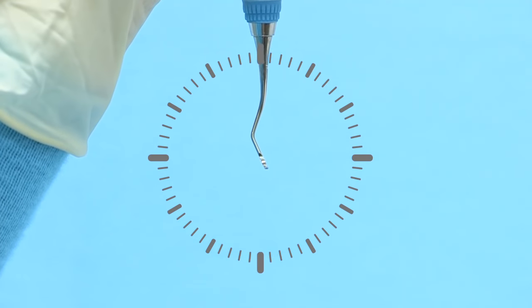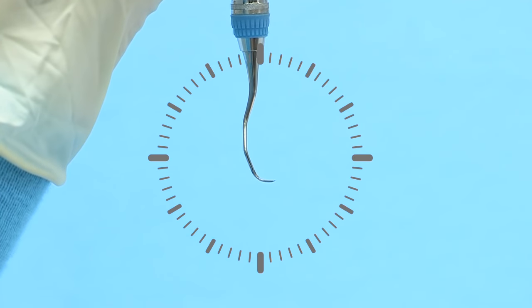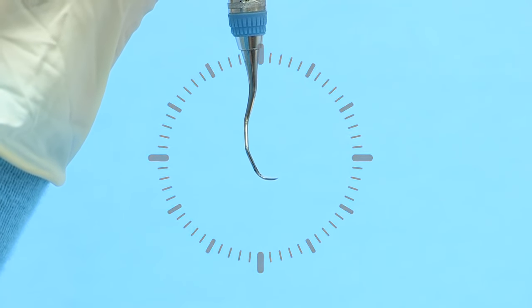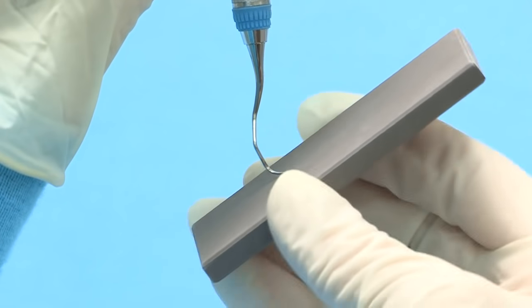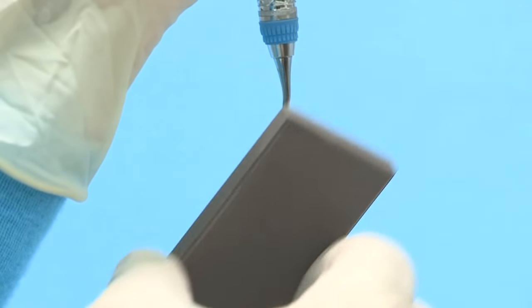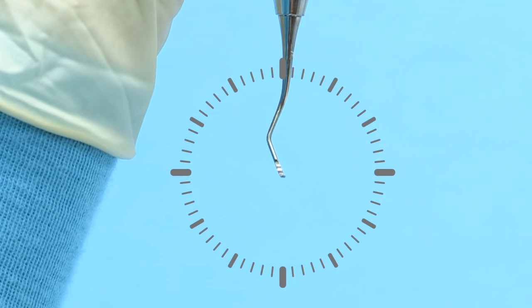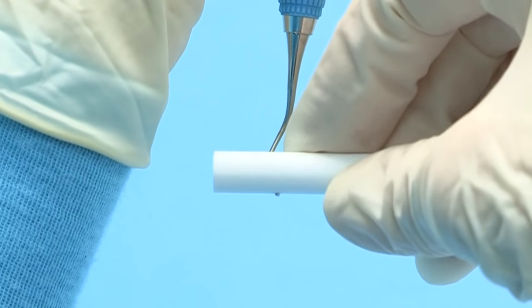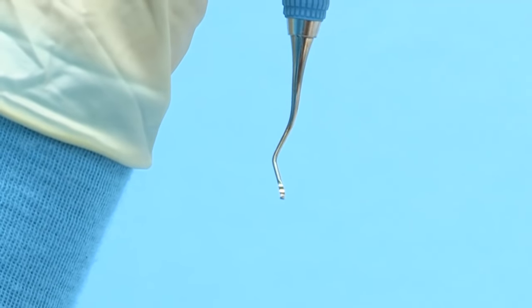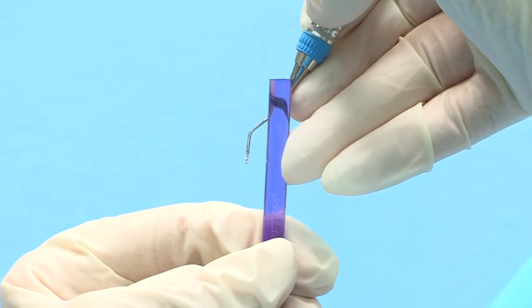To round the toe of the odd numbered Gracie curette, maintain the terminal shank at 3 minutes before 12 o'clock, then slowly rotate the instrument handle so that the toe is directed at the 3 o'clock position with the face of the instrument parallel to the table surface. Position the stone at 3 o'clock and tilt the stone upward to the 2 o'clock position. Move the stone in a consistent motion, overlapping strokes and rotating around the toe to maintain the rounded shape. Lastly, the facial surface can be finished by holding the terminal shank at 3 minutes before 12 o'clock with the toe pointed toward you. Position the cylindrical stone along the face of the blade horizontally at 3 and 9 o'clock, then lightly roll the stone along the face from heel to toe.